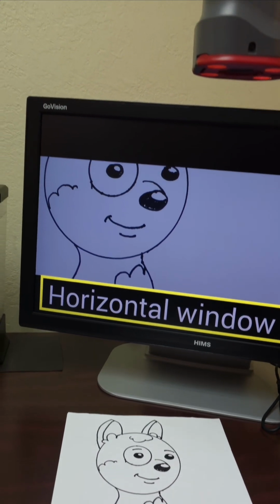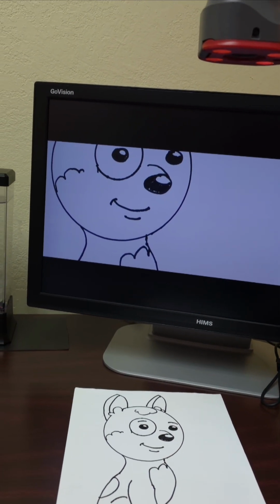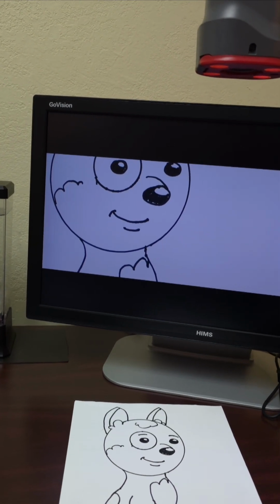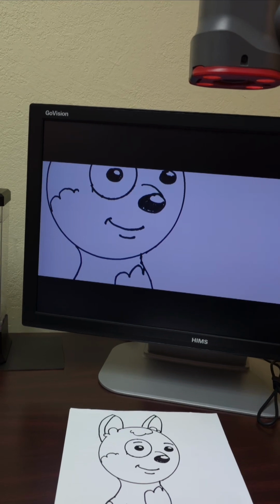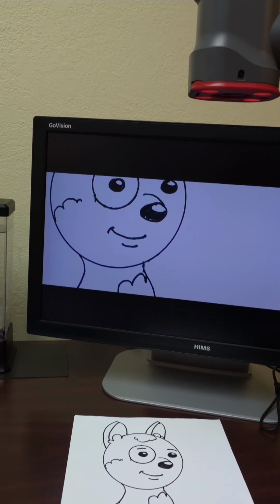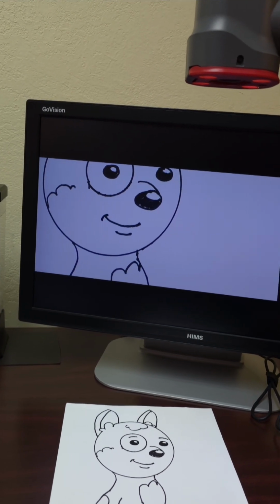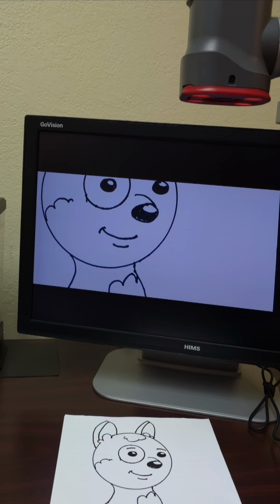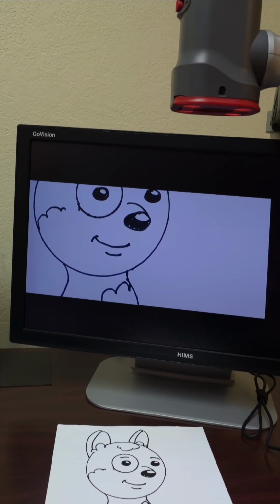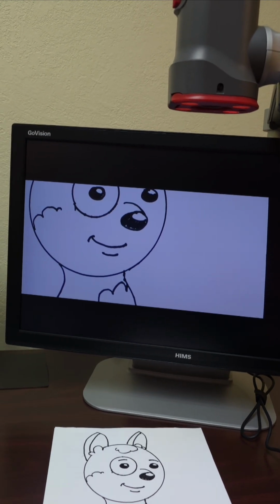So now we've got a window marker here, and I can always adjust how wide or narrow it is, but you can see that it kind of blocked off the top and the bottom of the screen. And that's if, even with the line marker, the text is still just jumbling to me and I can't really tell what it is or where I am, this will occlude the top and the bottom of the text, so that I can just focus on the line that I want to focus on.